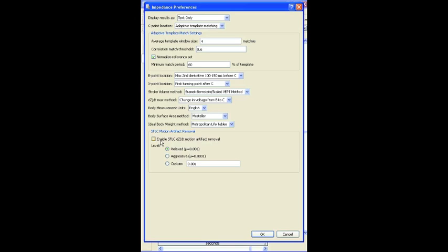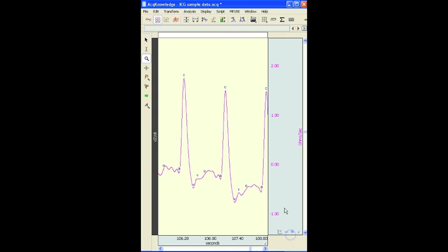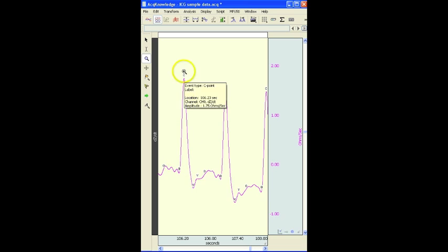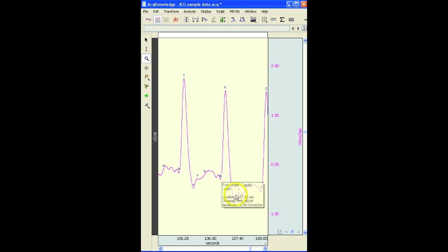The data that we're looking at today is clean. There's not a lot of noise or movement artifact. And the signals were analyzed quite easily. But as we saw, just using the default settings, we're reliably able to pick these out very reliably.